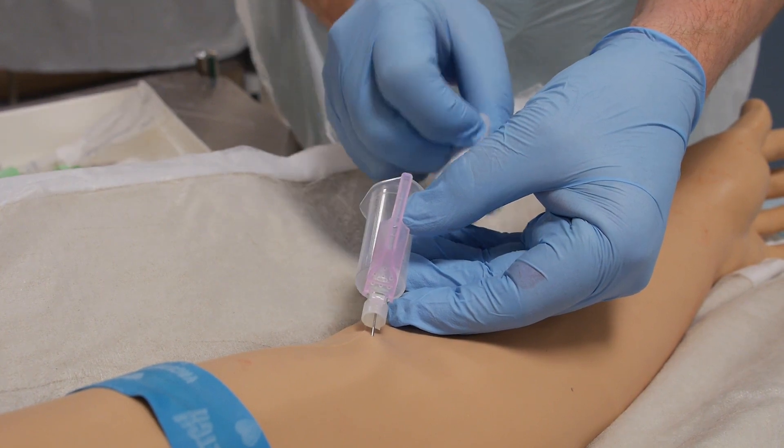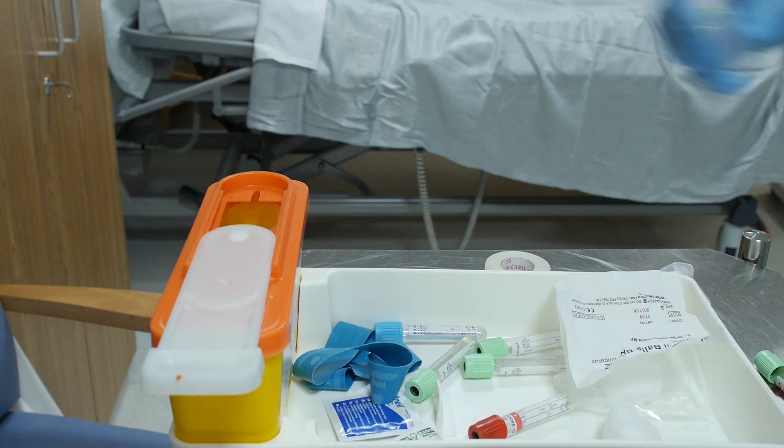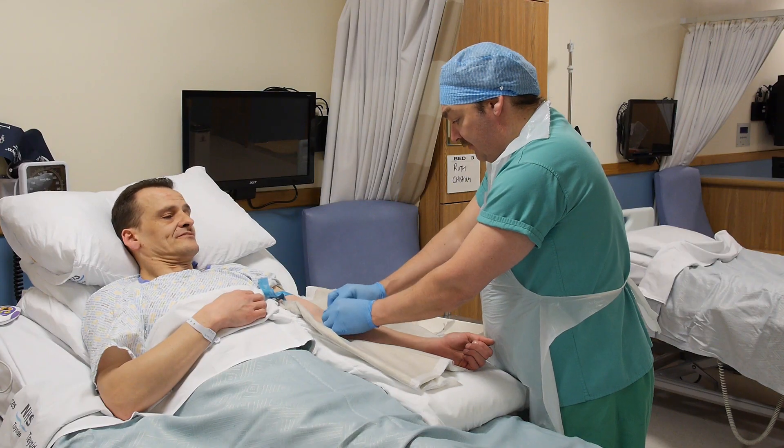Release the tourniquet to aid normal blood flow in the arm. Place a swab over the needle site, then activate the safety device before discarding into the sharps box.